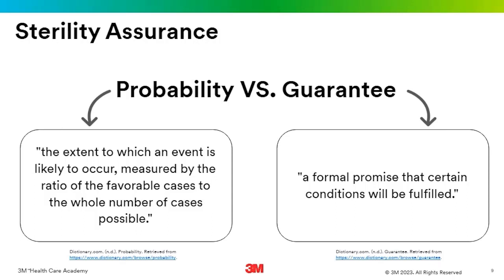Right? So if the autoclave load comes out and somebody touches that wrap when it's still warm, making that nice little bridge for the microbials on their hands to go into the set, we did everything we needed to do before it went into the sterilizer, right? Still, we touched, we've lessened that chance for complete sterility, right?